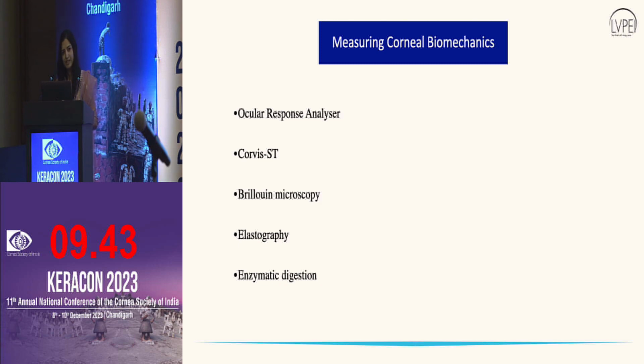Mainly it is the Corvis ST that I'm going to talk about, but there are other methods as well, such as the ocular response analyzer, Brillouin microscopy, elastography, and experimentally it is seen by enzymatic digestion methods.